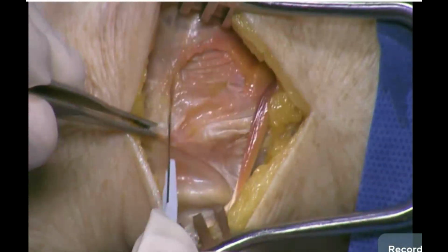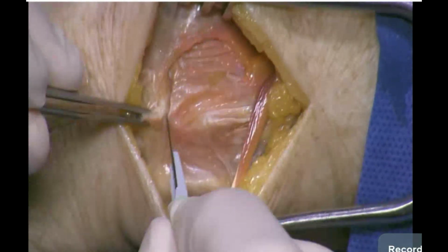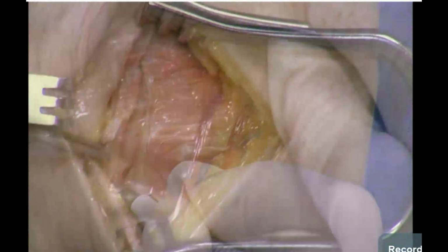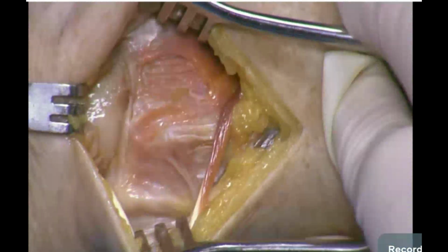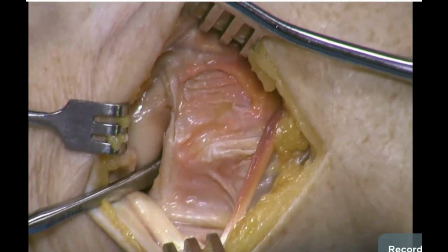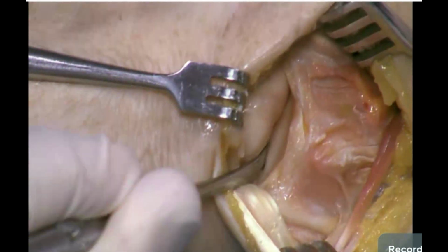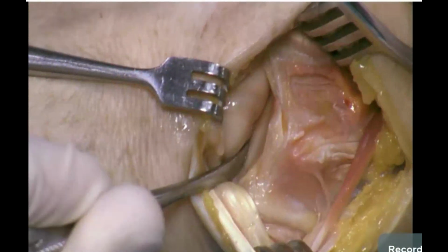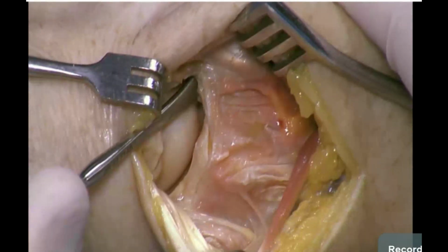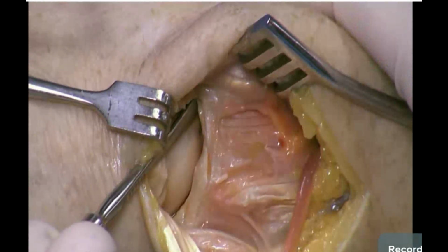And to allow access to the joint, the capsule is reflected off of the dorsal lip of the distal radius. So in a specimen here, we don't have traction to our advantage, but this can be pressed down. I can see into the joint, visualize this fairly well. So the access to the joint, here's my scaphoid facet, working over to the lunate facet. A little tougher to see, but can be seen, especially under traction.